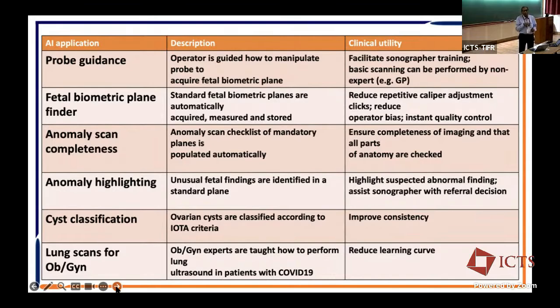In India, for example, you are not allowed to identify the sex of the baby. So the government came and asked us, can you make an ultrasound machine which, when you move the probe to the area of the genitals, makes the image disappear, so that no doctor will be able to identify the sex? The government actually called us for a meeting on this. And from IIT Madras, they said, yes, this is possible.